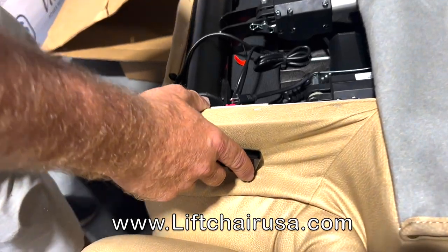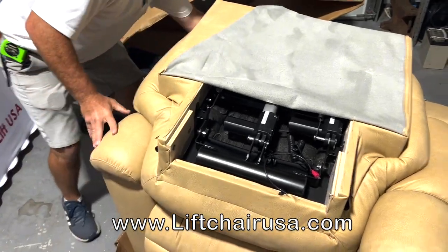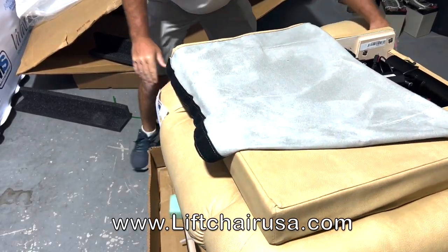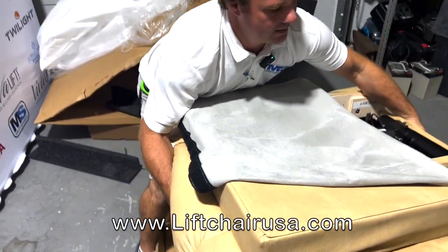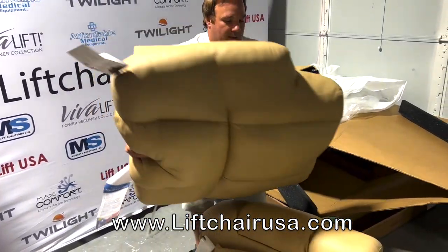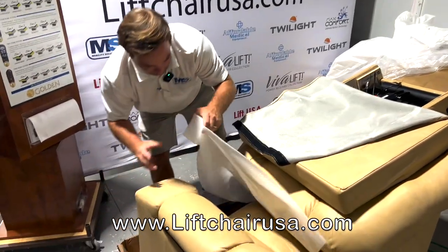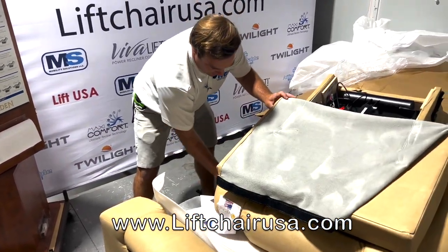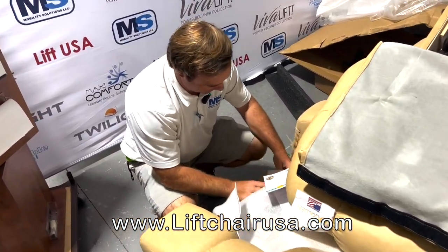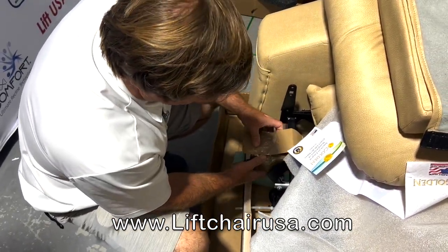So basically all you're gonna do is, this is the front of the chair. This is the back. Take this. And this is a little heavy because it's got power pillow and lumbar, and there's a box right there. So let's remove this. Take this off of the right here. And there's another box that you need to remove from here.